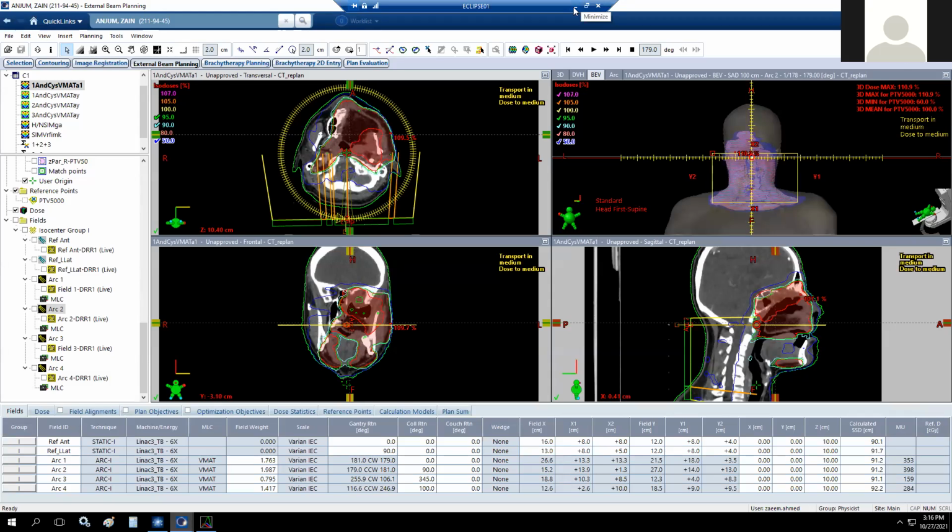There's another question. Are you controlling gantry modulation or just letting it go? Because PDIP sometimes does not incorporate it very well. Sharif, you are asking only for PDIP? Well, Sharif, if you're asking for PDIP, no, we are not controlling gantry modulation. It's just on the same position, and you can say it's just let it go style.